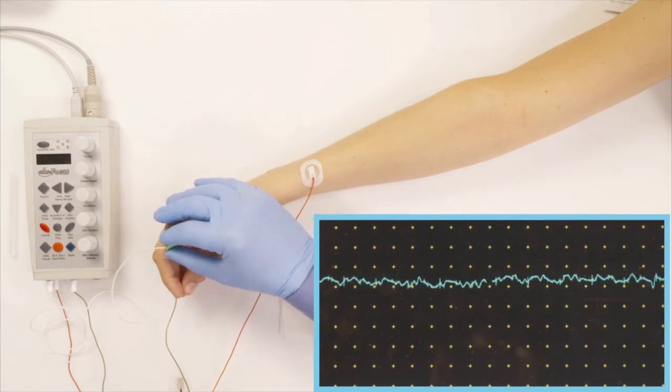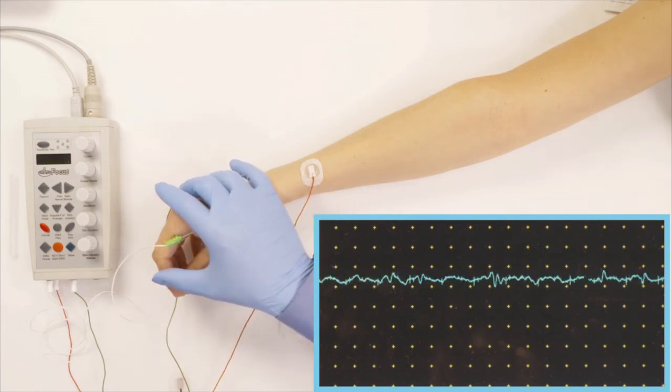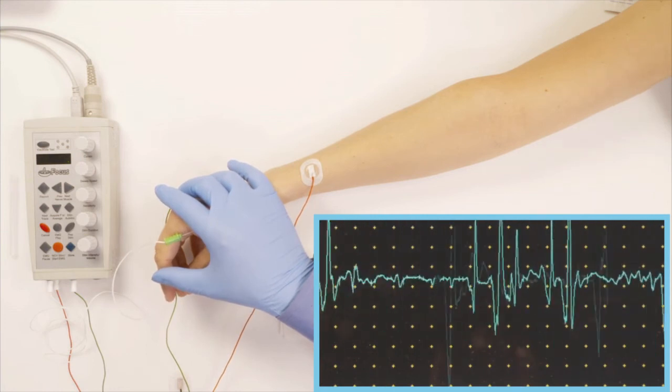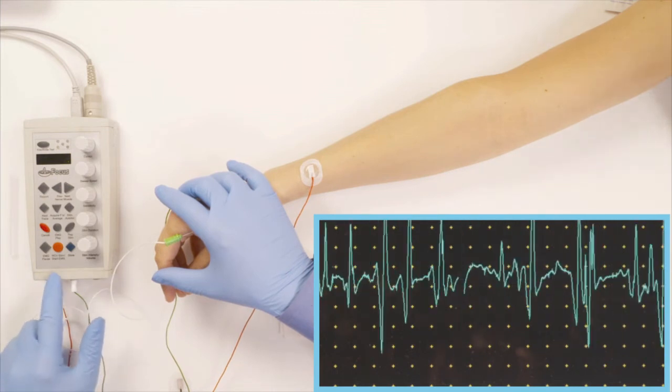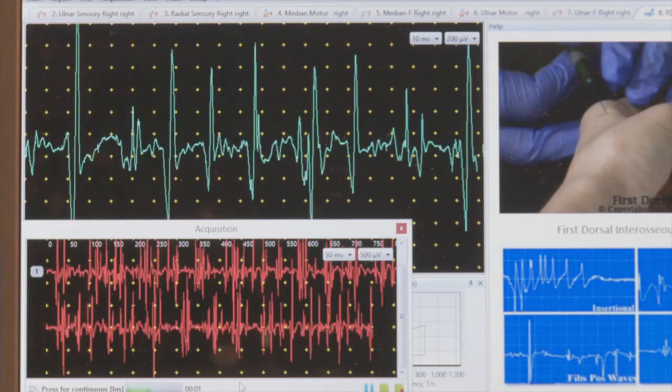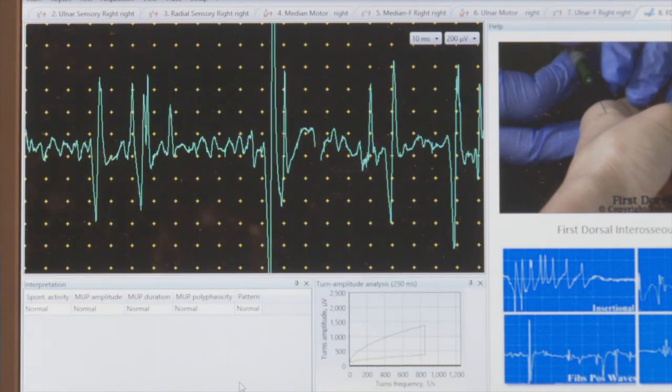So the next thing that I do is I'm going to start looking at activation. I do it at three different levels. I ask her to activate the muscle just a little bit. So pull up just a little bit. That's mild activation. And as soon as I like this mild activation, I start recording this. And here you see this on the screen showing up. As soon as it fills the screen, I press store.